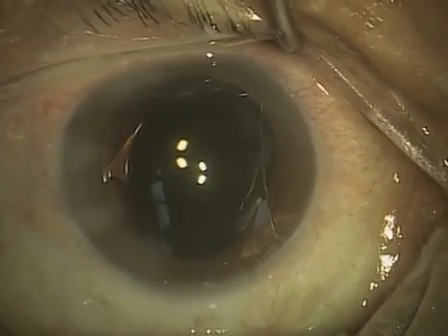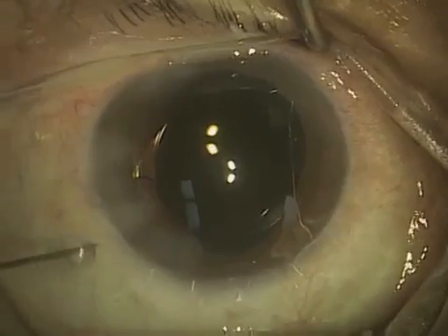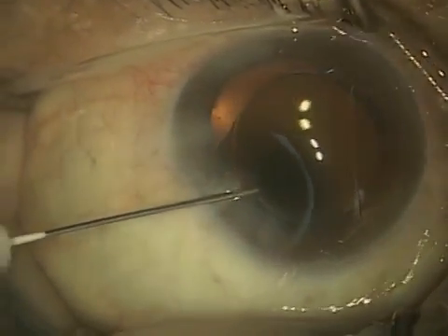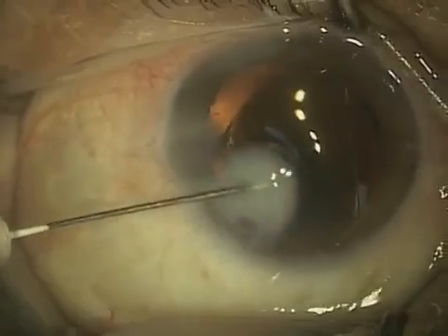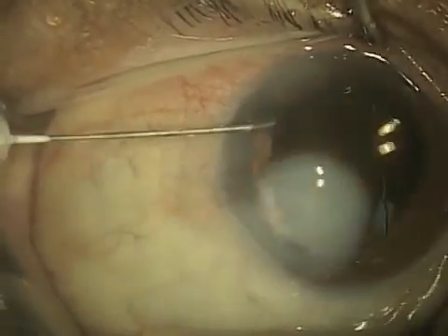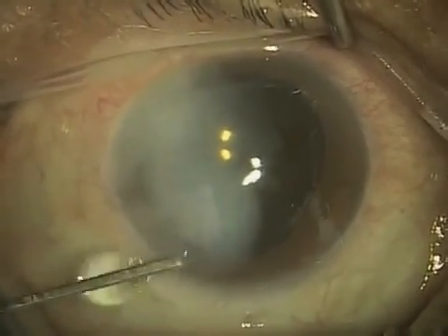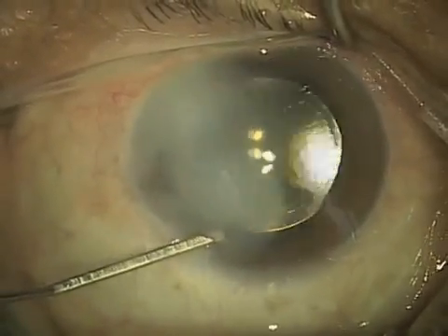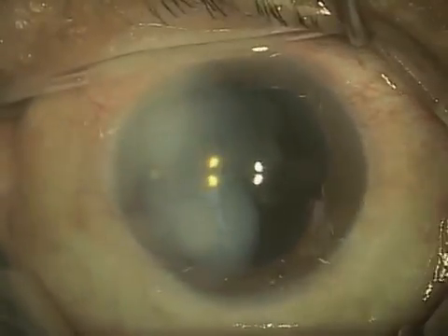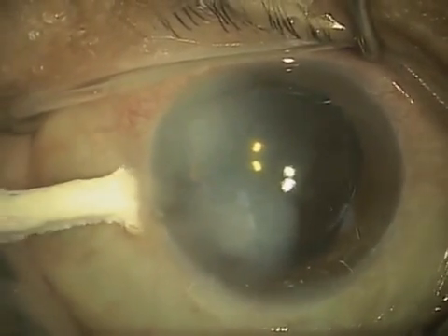Now we're pretty much done with the surgery. What I'm going to do before I'm completely done is inject an antibiotic solution into the corneal stroma — so this is actually injecting it into the cornea itself, and it whitens the cornea. It's not pretty, but this is going to go away in the next 24 hours. What this does is it helps close the incision and gives this patient some protection from infection. The first 24 to 48 hours are absolutely critical.